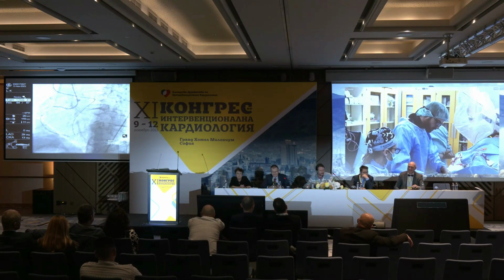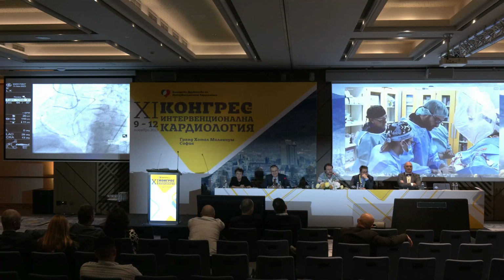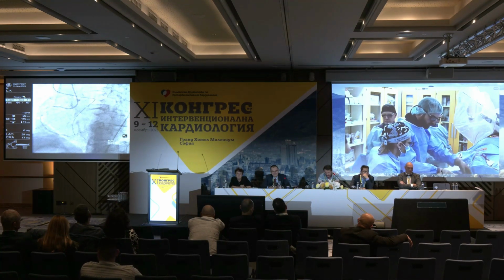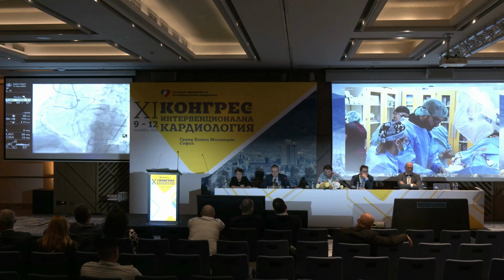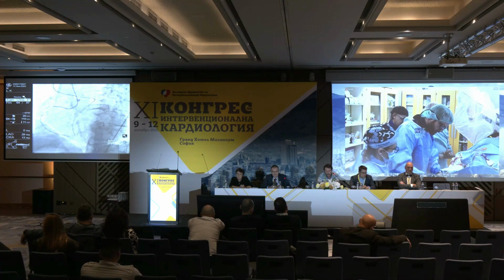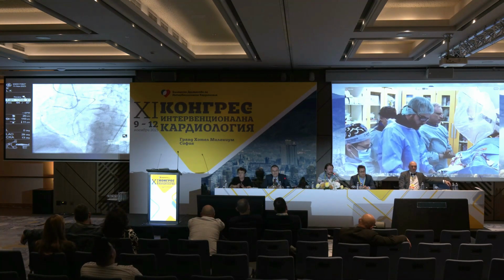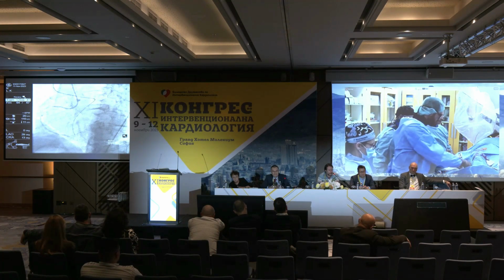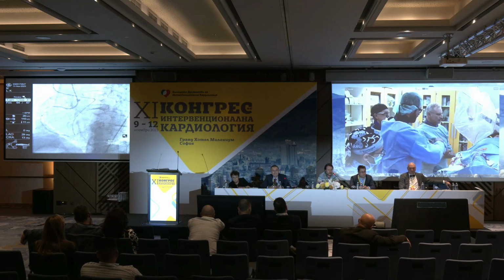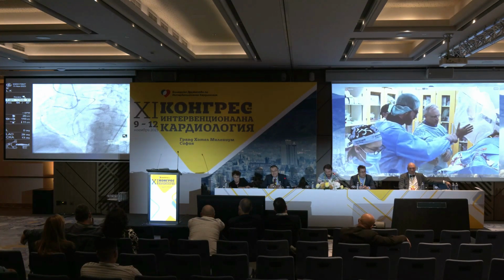Your comment was politically correct. For me, every time I do an antegrade attempt, I consider it a preparation for retrograde. Simply, I didn't want to lose time on an antegrade without a retrograde marker. Yes, of course. That's why I wanted to have a wire, so I stopped giving contrast, and then you can do the antegrade part. The chance it works is 25%.